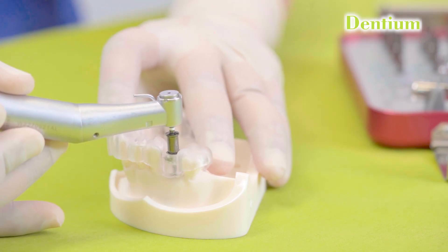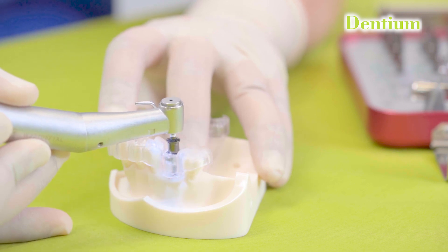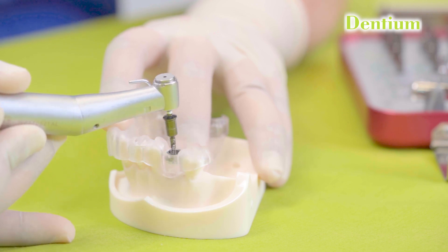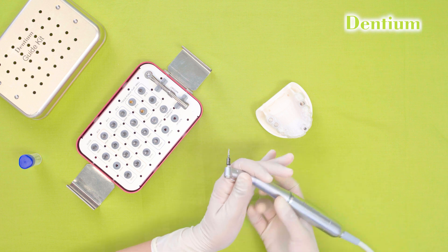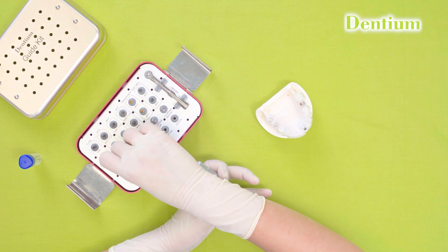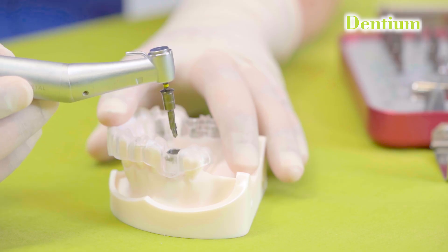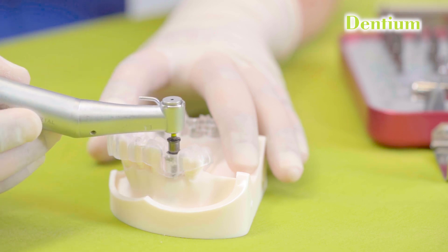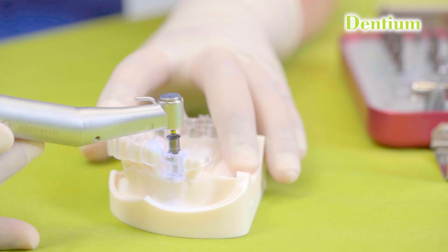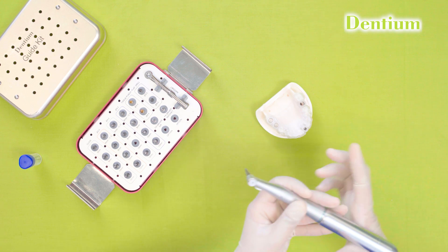The speed at which the drilling will be done will be approximately 800 to 1200 rpm, depending on the quality of bone, and the drill has to be used with saline. Complete insertion has to be done of the guide drill. After the guide drill, I will be using the 3.6 mm drill, which again has to be completely inserted.